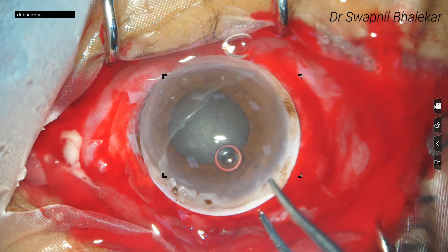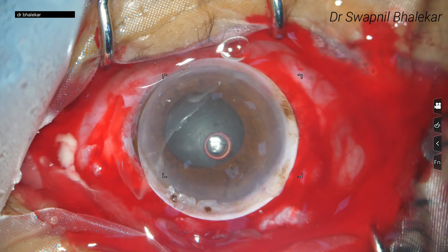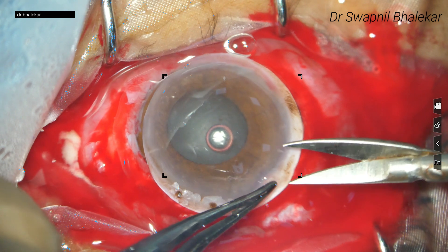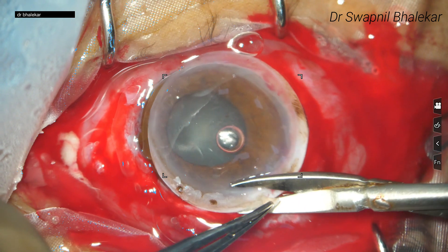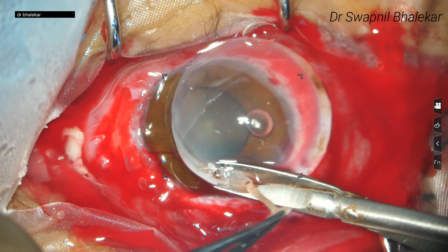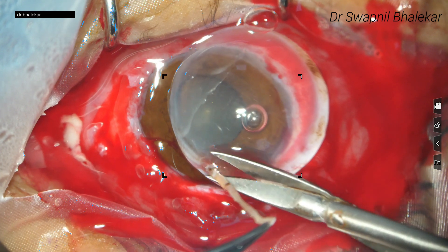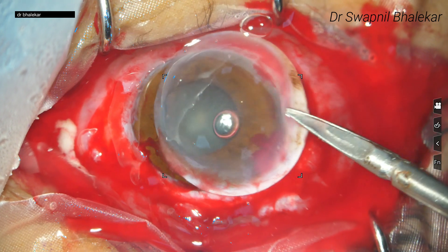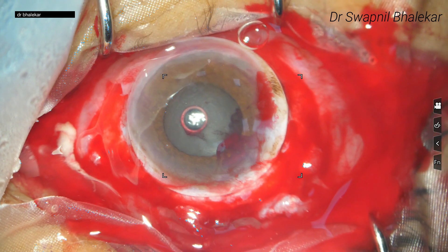We have prepared a 12 mm donor cornea. You can see it includes some part of the scleral rim as well because it's a larger graft. The graft always includes some part of the tissue over the sclera. Make sure that the scleral ring is positioned on top so that it will be covered by the eyelid and will give a better cosmetic appearance.